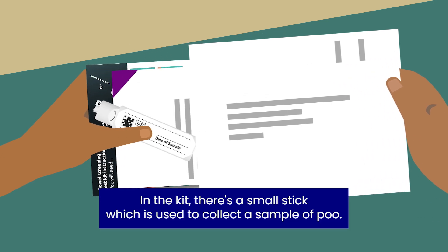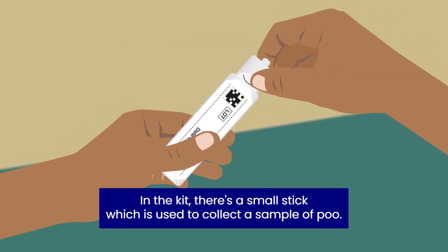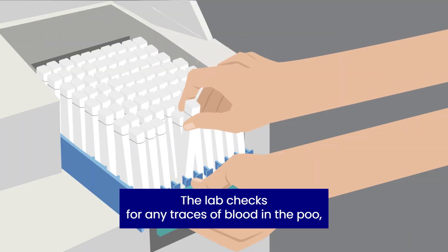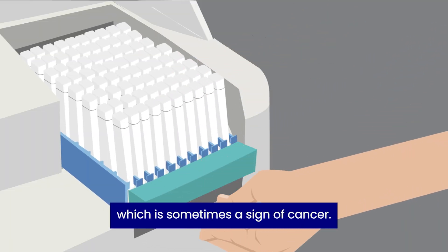In the kit, there's a small stick, which is used to collect a sample of poo. The lab checks for any traces of blood in the poo, which is sometimes a sign of cancer.